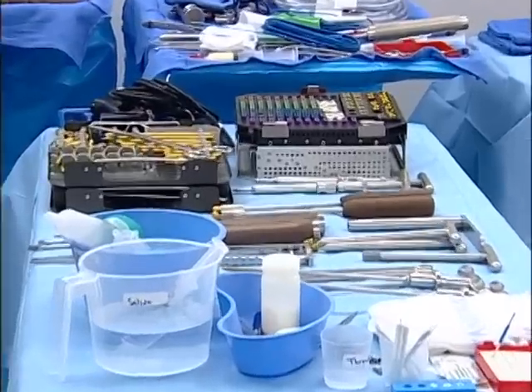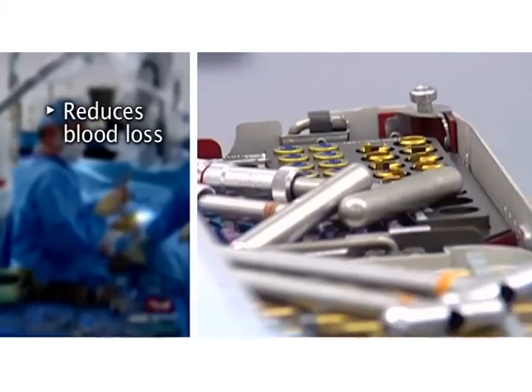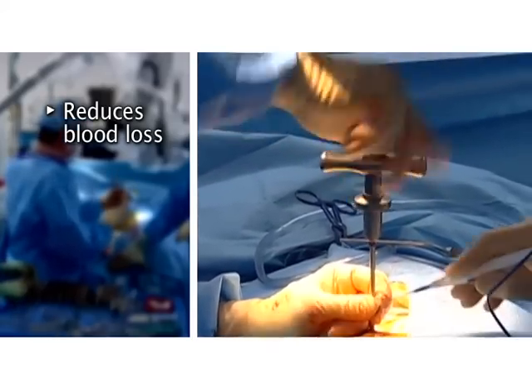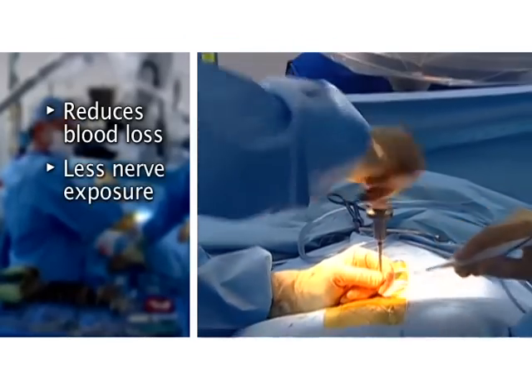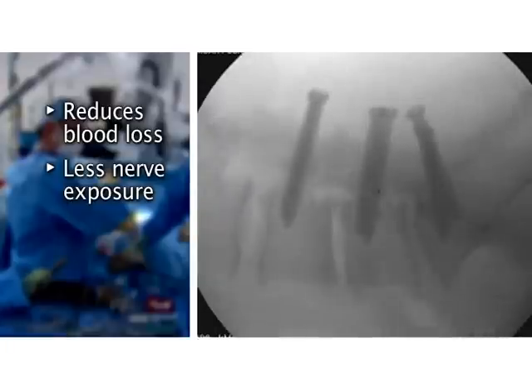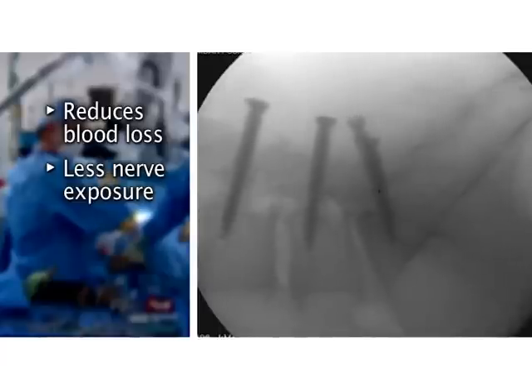There's no question there's a dual role in putting the screws in first. One, there's a lot less bleeding and oozing at this phase of the case, which really reduces the blood loss considerably in terms of putting the screws in first. The second reason it's an advantage is that once you've done all your dorsal midline decompression, particularly in a percutaneous wound, the nerve sac, the thecal sac, the nerve roots are all potentially exposed to the introduction and delivery of instruments in and out of the wound.